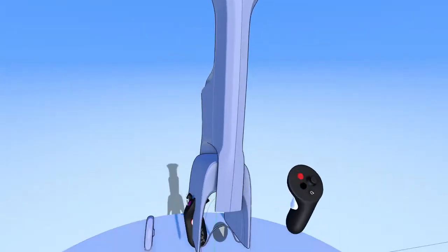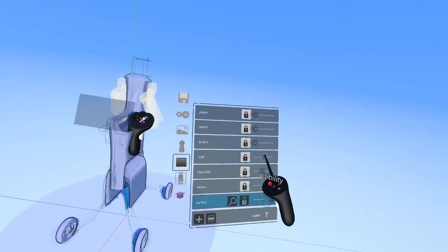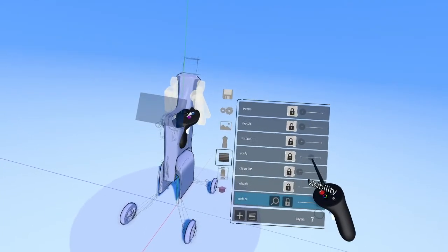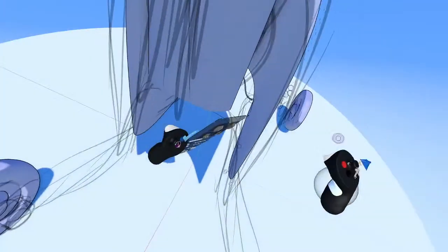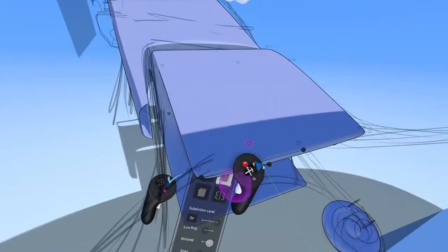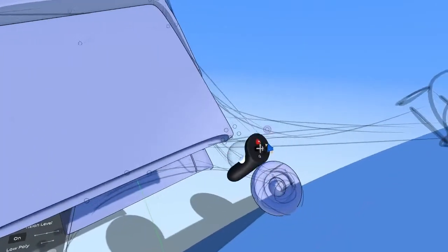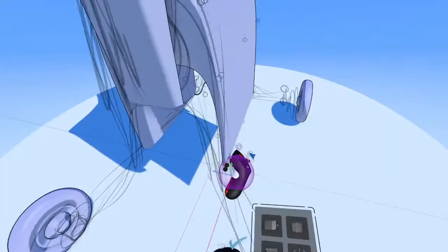Okay, so now we have the body pretty well worked out. Let's turn on our sketch layer here. Oops. Not the clean line, but the robot sketch, and get an idea for these legs here. All right, so now we can just turn on our sub-D geometry and shape to it. So actually, I'm noticing that I want this face here, down here, to be exposed so that I can lead that into the legs.